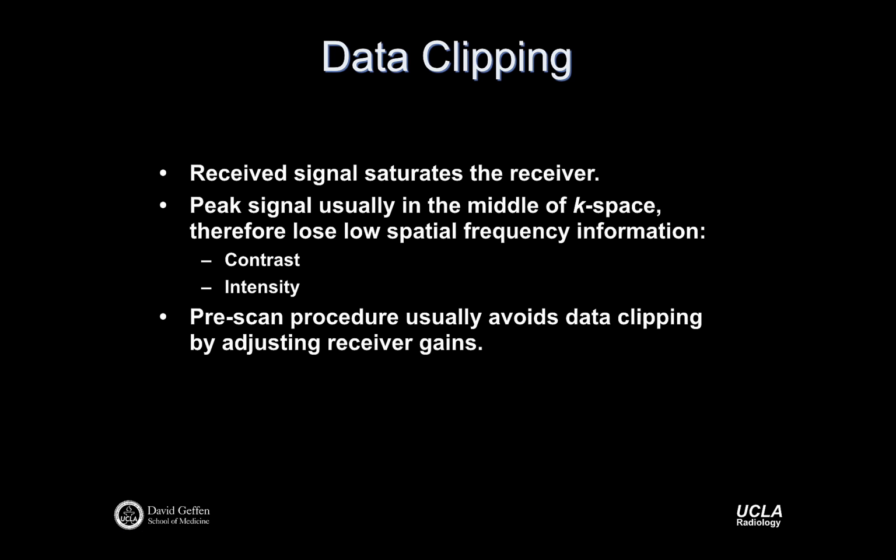Okay, so that's a very high-level overview of how motion can lead to artifacts in MR imaging. And then I think what we'll do is we'll talk through data clipping and then possibly take a break.